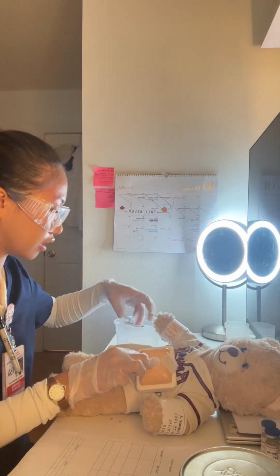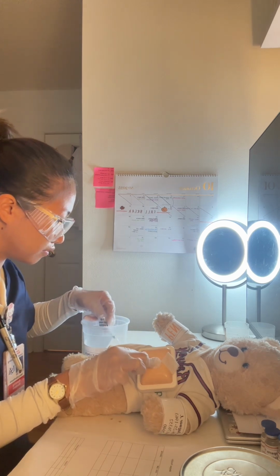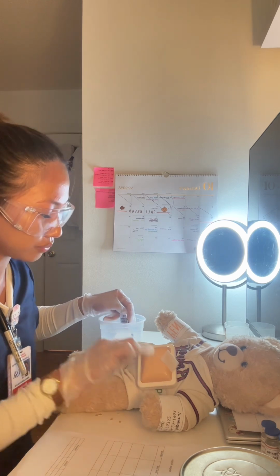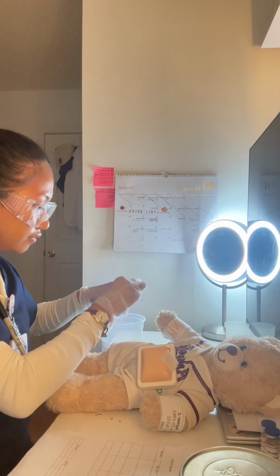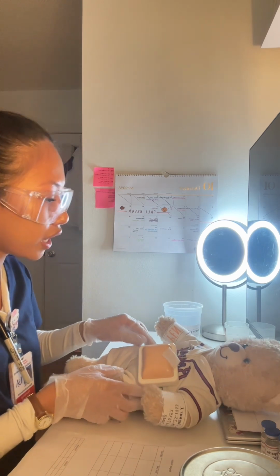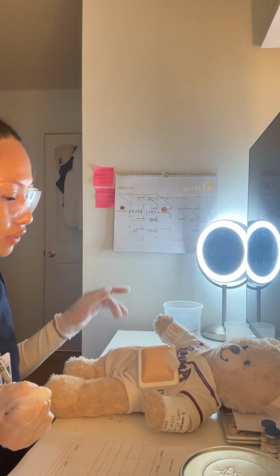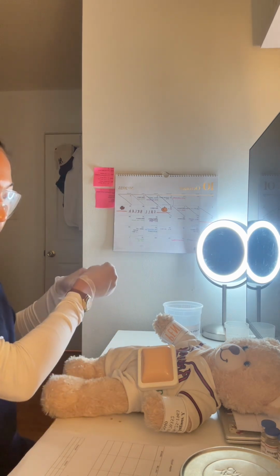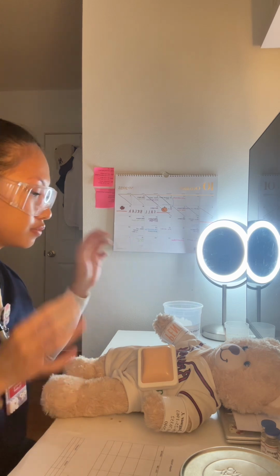Oh, okay. Well, if I can. All right, Mr. Jones, I'm applying a little bit of pressure right now. There you go. All right, Mr. Jones, are you doing okay? Is everything good so far? Yes, I'm perfectly fine. All right, I'm gonna go ahead and remove this alcohol prep pad. And remove this.